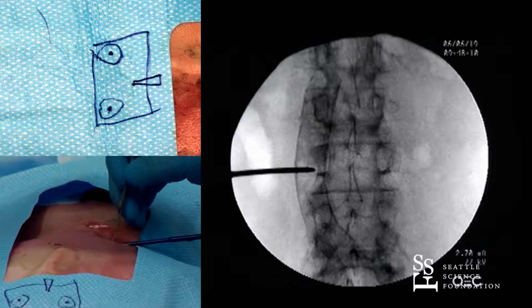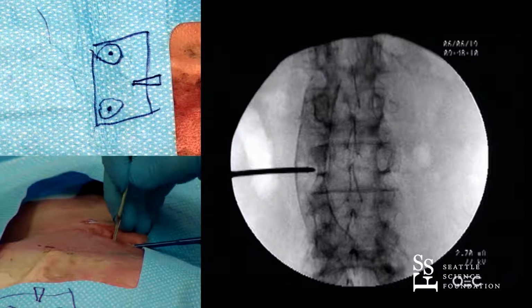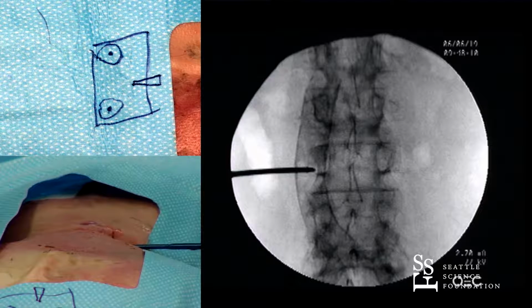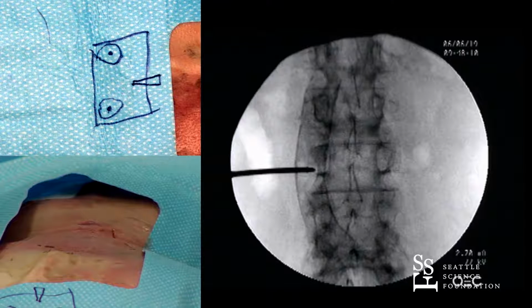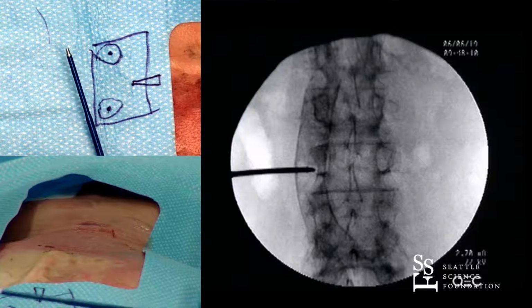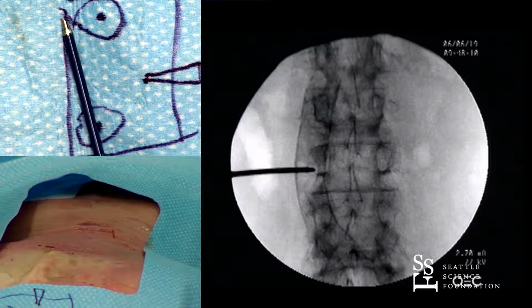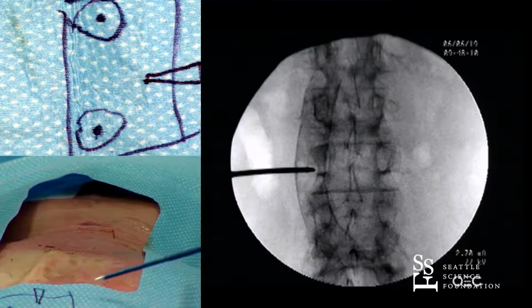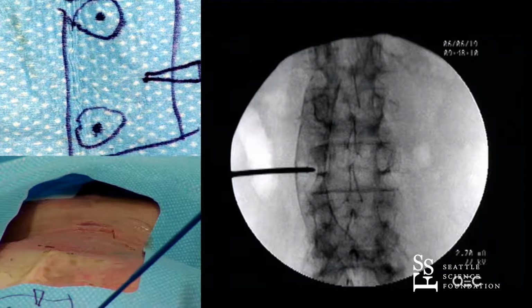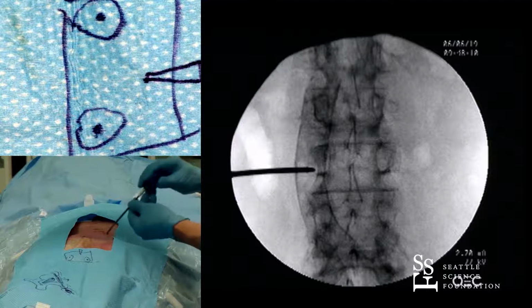I'm going to go a little bit lateral. So here, there you can see is the needle that we use. It's cannulated, so I can take that stylet out, and then I'm going to advance a guide wire. And so you're going to see me go in just like this, or just like that.